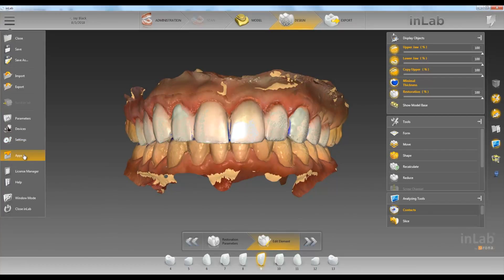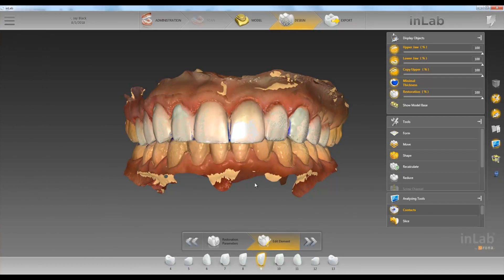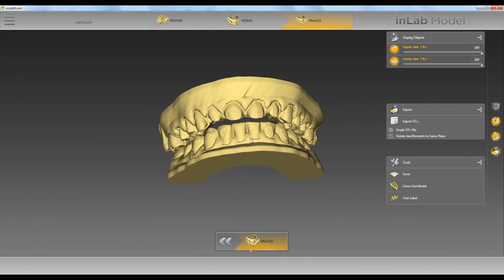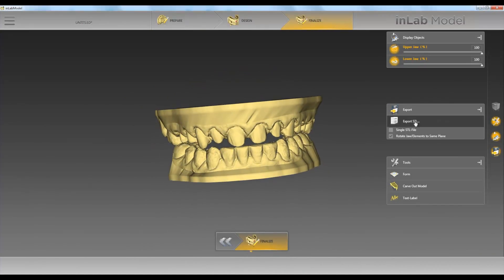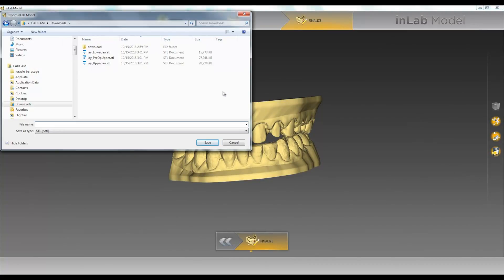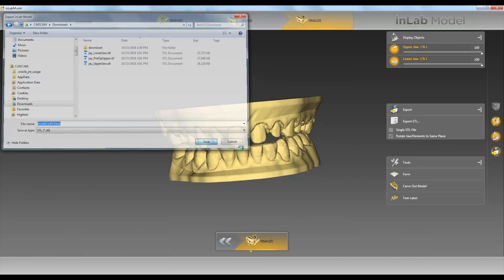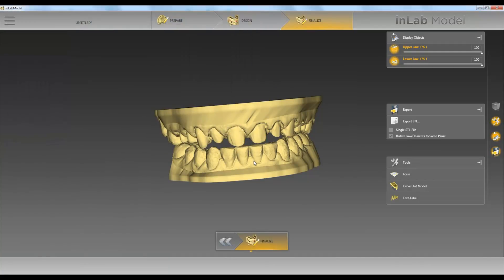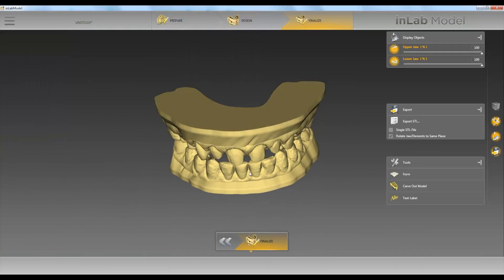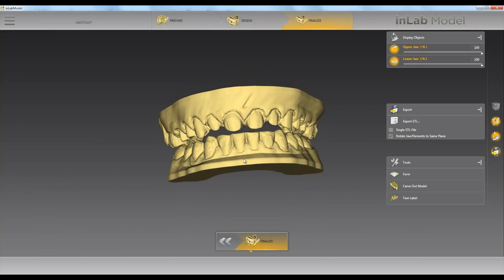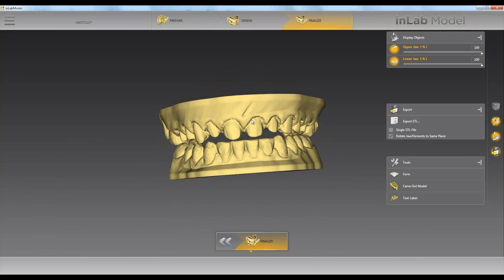If we want to export these as an STL with bases, you would come up and open the apps, open up the model software, go ahead and build your model and put a base on it. Now we can export here as an STL and go ahead and save it under whatever name you want. Once you save it, it'll go ahead and save as the upper jaw and lower jaw with a base on it.